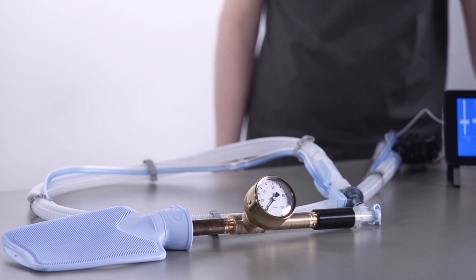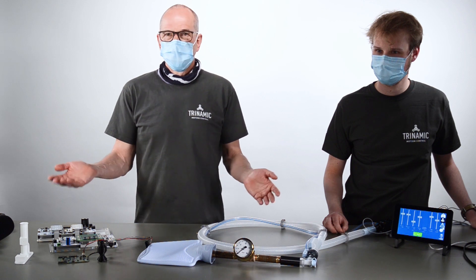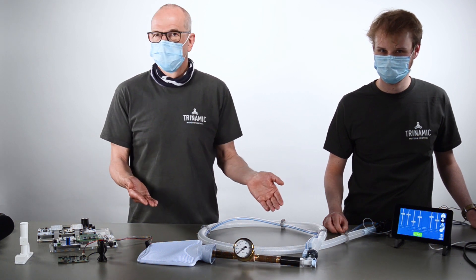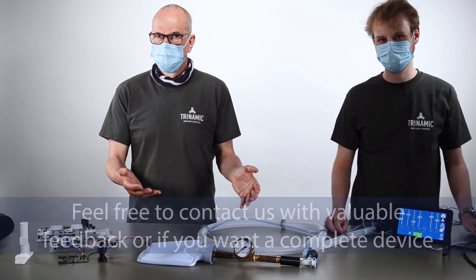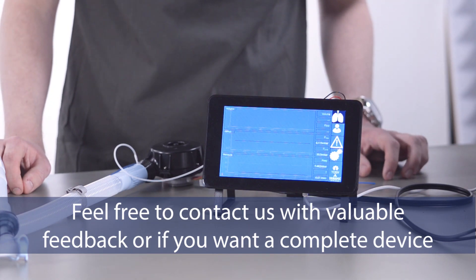Everything is available on GitHub — it's open source. What we need now is the support of the community to give us feedback. Is this useful? Is this helpful? What should be improved? What has to be done? We need the application experts to give us feedback or to take it to the next step.